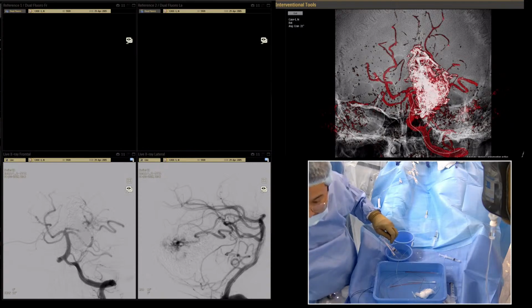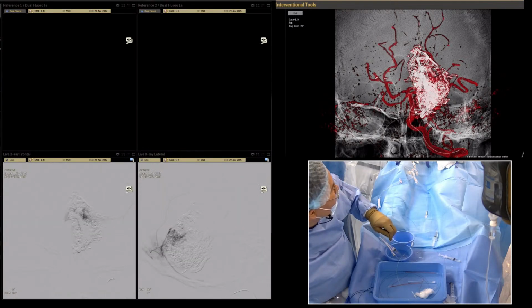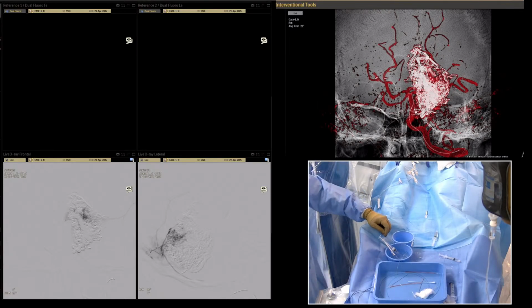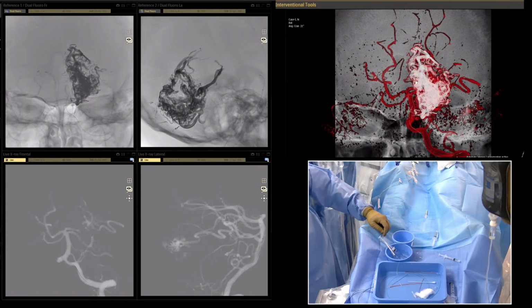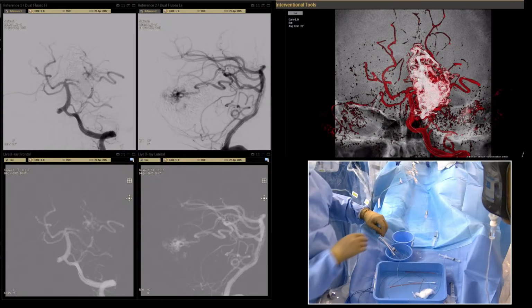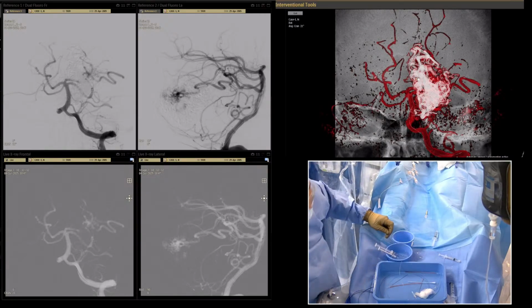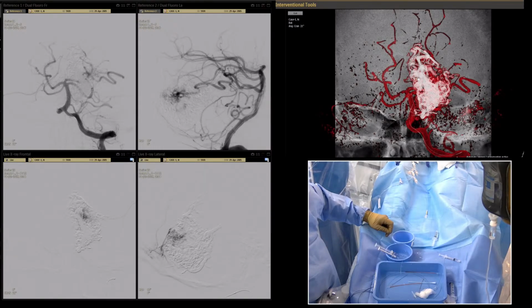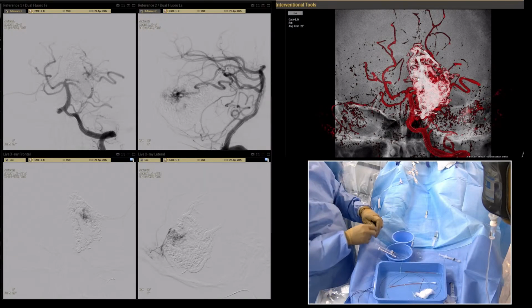It's a smart mask. And then we may compare this part with this part. I think it's the same territory, yeah?